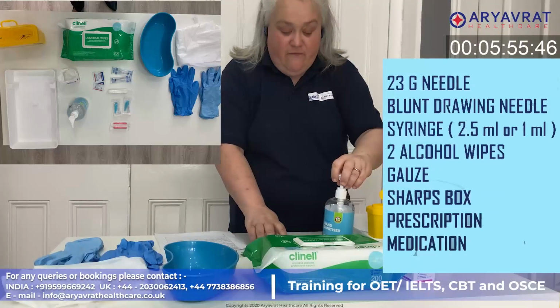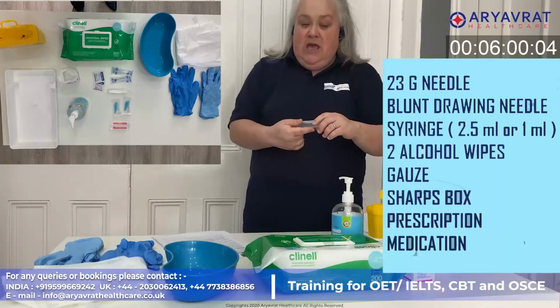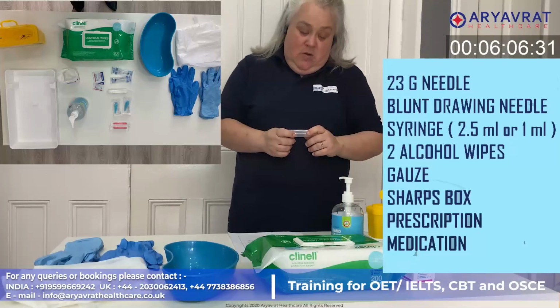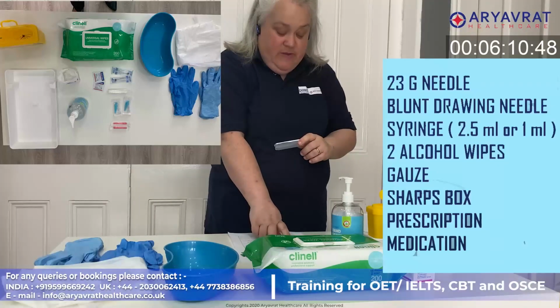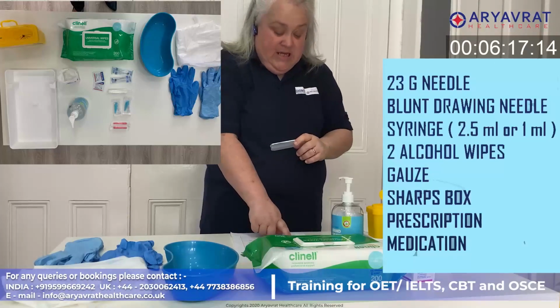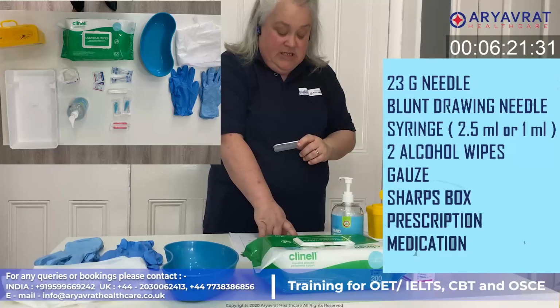What I will do before I start is do a 5 rights of medication check. I've already checked with the patient. I know I've got the right patient. So we have here Frederick Goldsmith, date of birth 24th of the 12th, 1934, and Fred doesn't have any allergies.